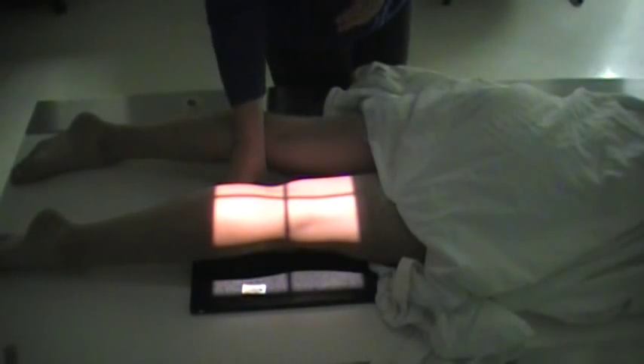I have put the IR underneath the knee and I have marked it. The next part is somewhat difficult for the patient. That's why I like to have everything set up ahead of time, because once the patient gets into position, they're not going to be able to hold this long if they're having any pain in their knee. Now I'm going to have the patient get into a kneeling position.